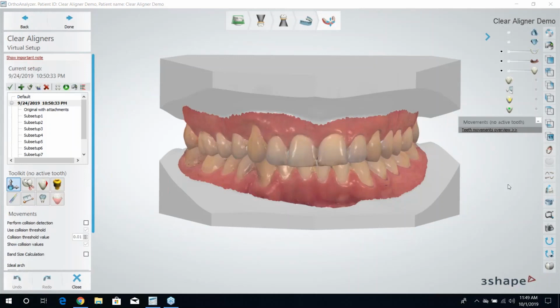Okay, so Sandra. Hi, Sandra. If we add this to our system, what kind of training would we get? That's a good question. A standalone Clear Aligner Studio training, I believe, is a 1-day training. Let me double check with Chris on that.